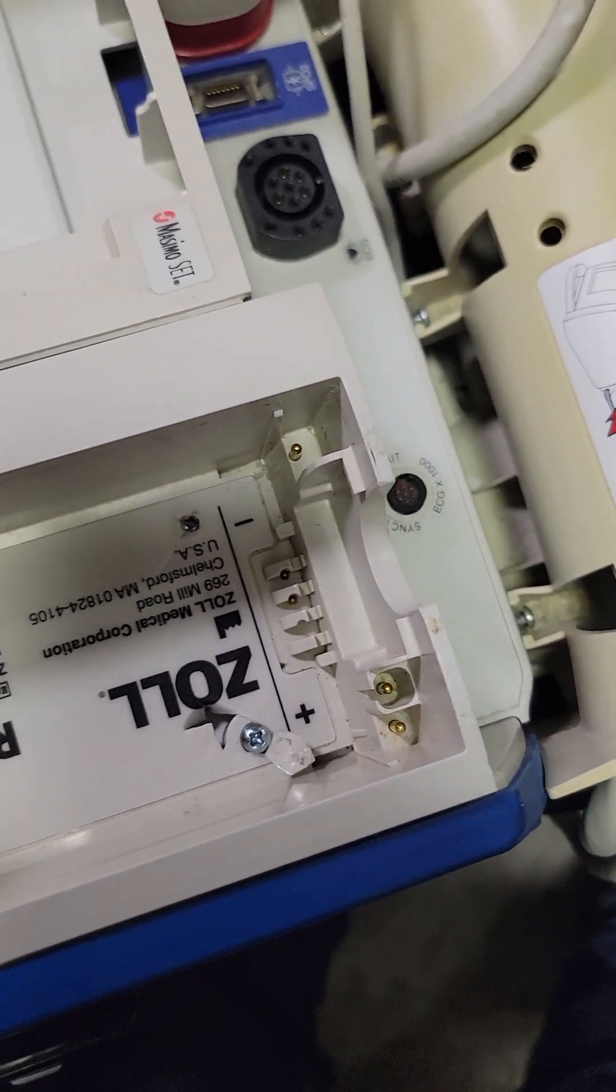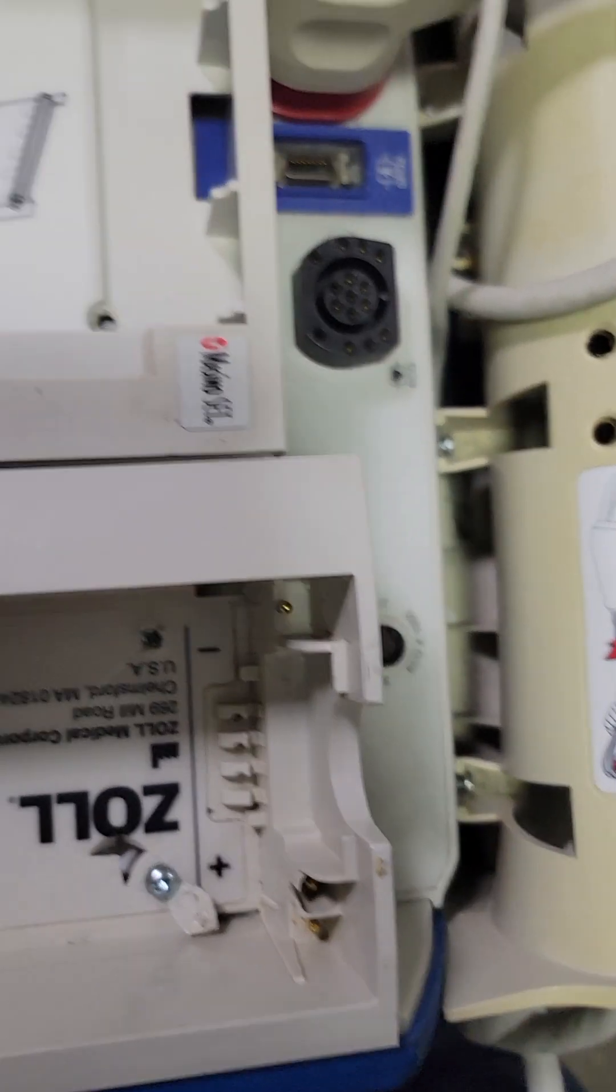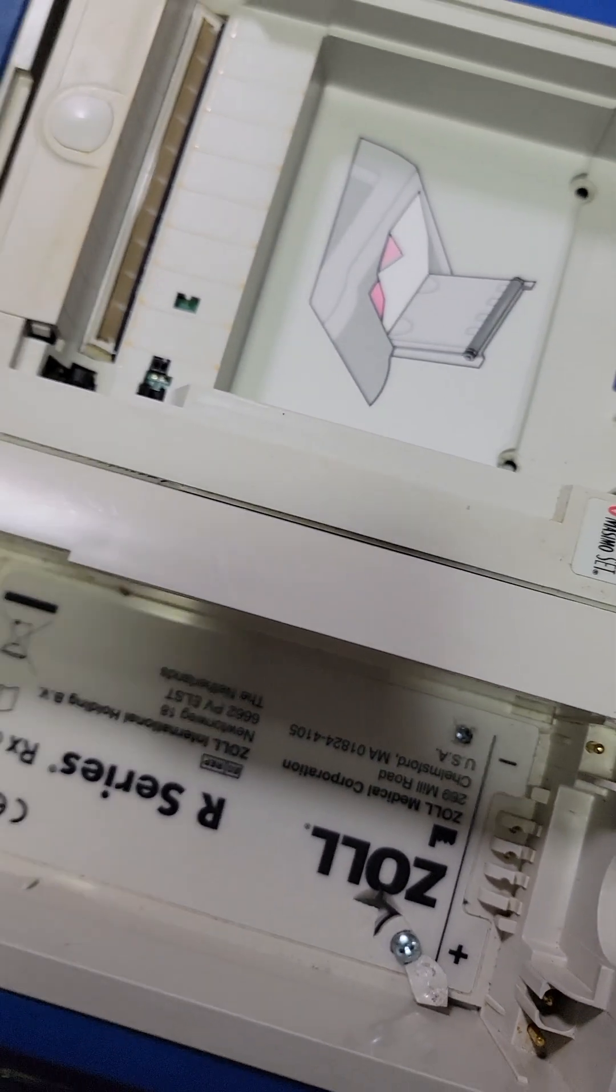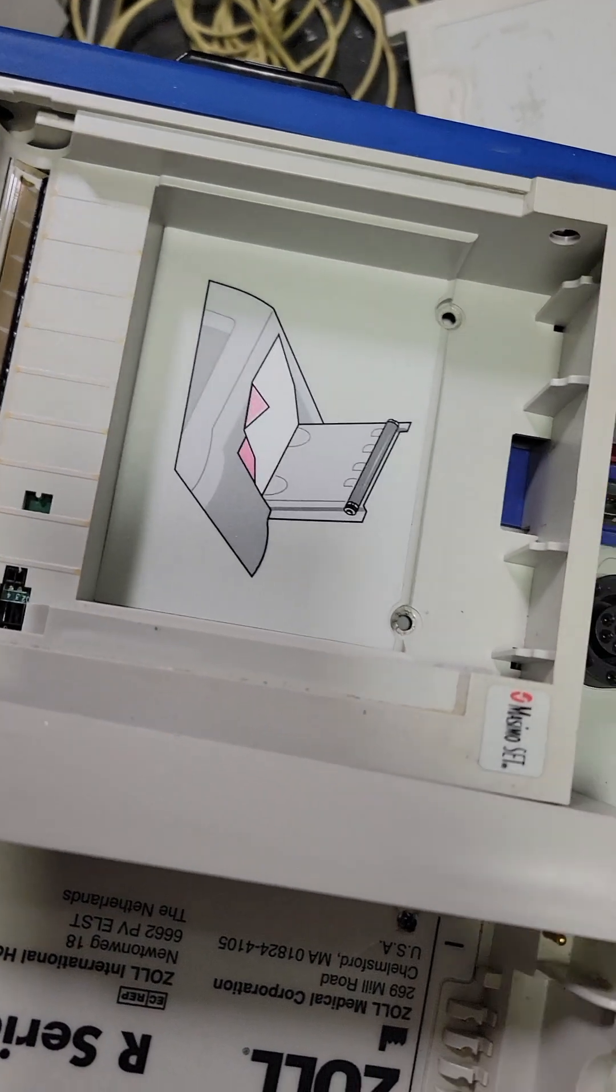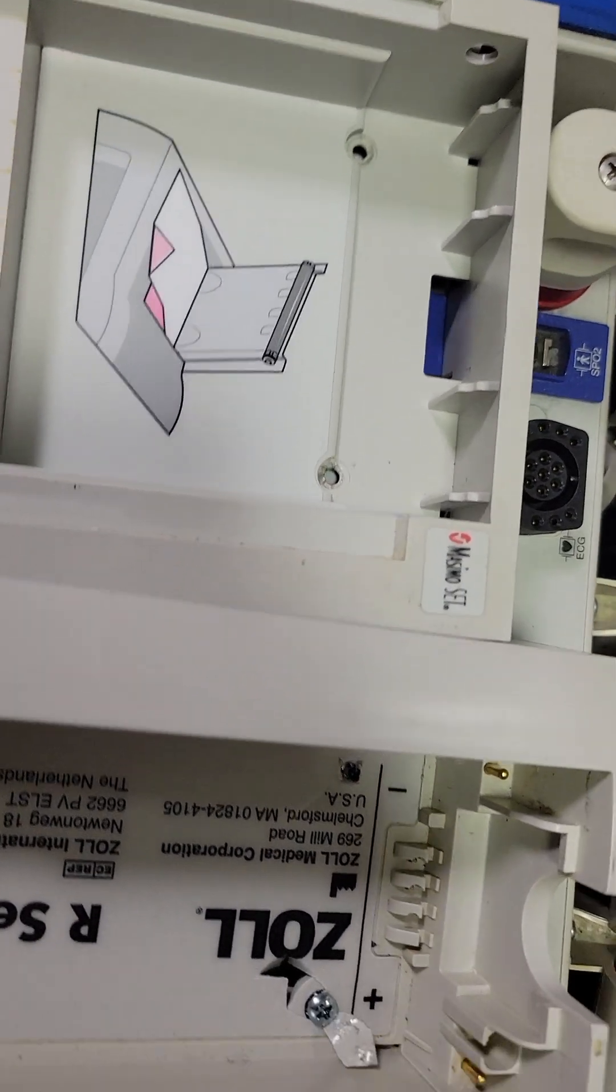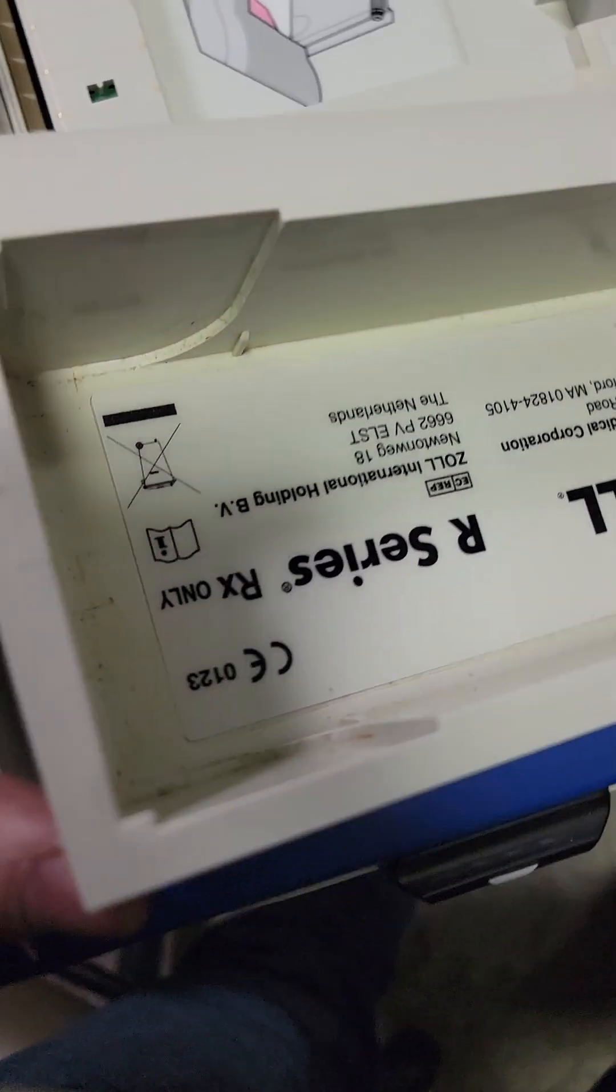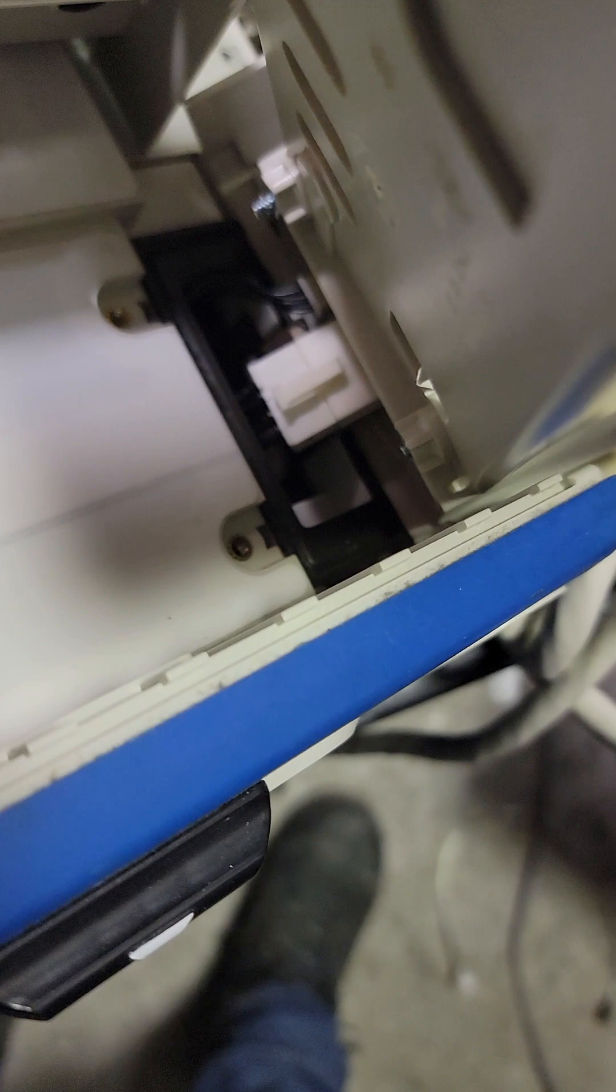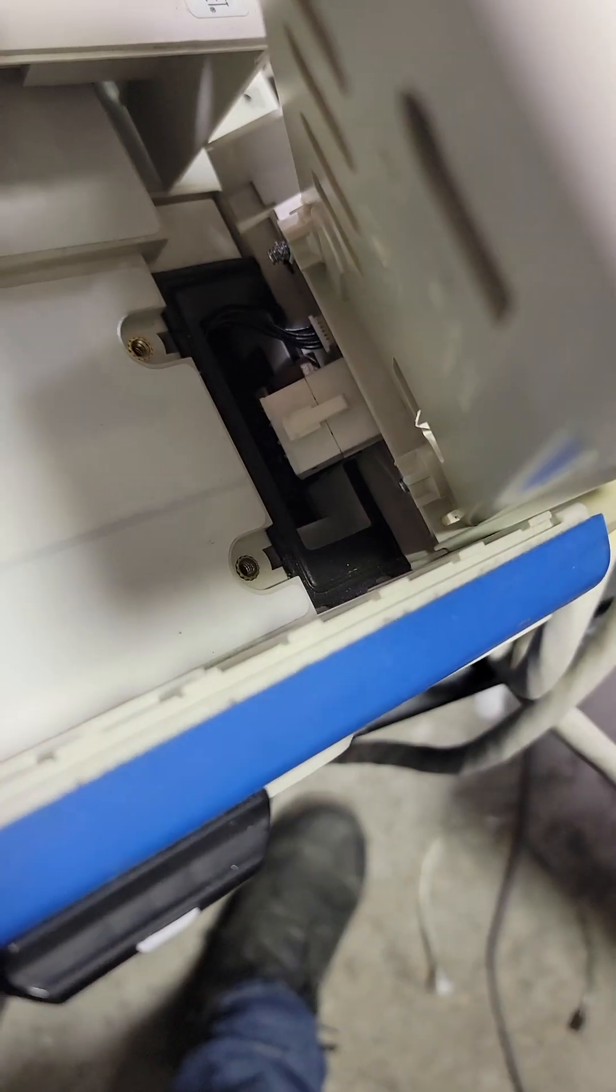Then you just have to pry this up and back, like that. And your connectors are back here so be careful when you get this up and out. Don't bother unplugging that, there's no need to.